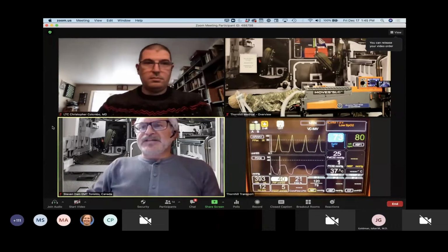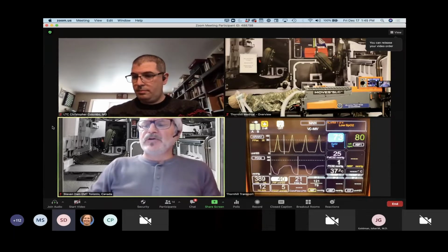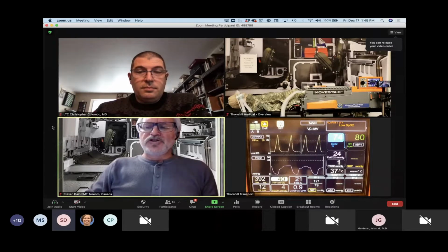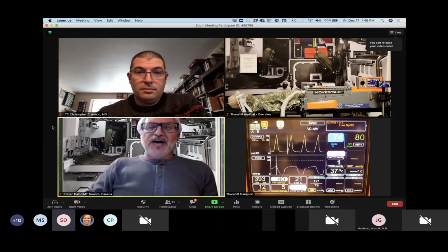Hi, I'm Stephen Dane. I'm an EMT at Thornhill Medical in Toronto, Ontario, Canada. There was a tornado that ripped through the countryside just north of Toronto with a large number of casualties. Our ICUs are full, and we're just loading a patient into an ambulance to transport to the airport. All of a sudden, the patient's blood oxygen levels, or SpO2, are dropping. I need some expert help.